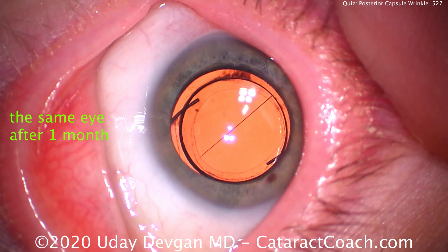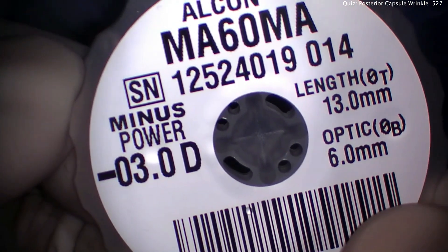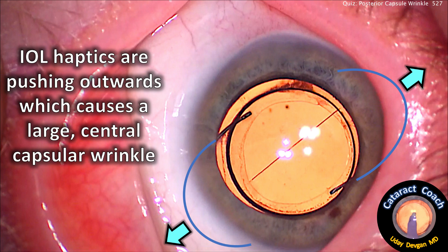So what was different about this case? Well, first of all, the patient is very myopic. The lens used was a minus three diopter lens, and notice this lens has a 6mm optic, but the haptic-to-haptic length is 13 millimeters. We put the lens in the capsular bag, and the IOL haptics are pushing outwards, which causes a large central capsular wrinkle. Despite being ultramyopic with a very long axial length, this patient didn't have an overly large anterior segment. In fact, her capsular bag diameter was relatively small, so the pushing force of those haptics is causing that stress wrinkle in the middle of the posterior capsule.